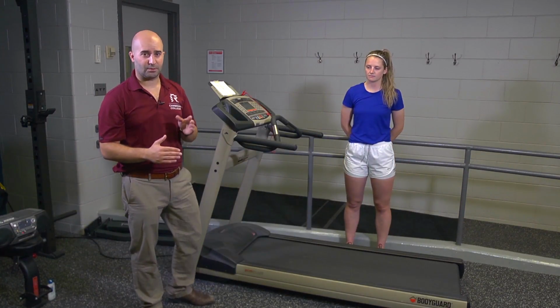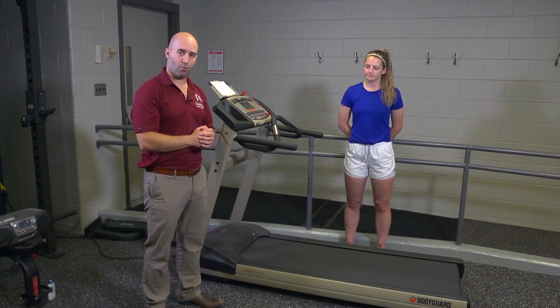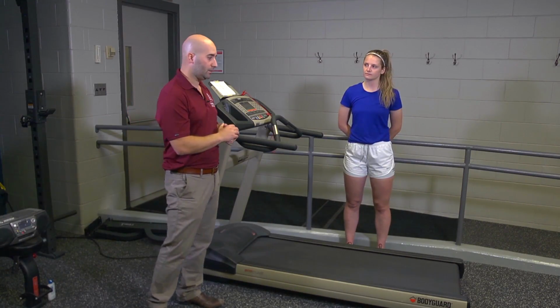The range for everyone is between 120 and 150 beats per minute. And so essentially, at the end of the 4-minute warm-up stage, I'm trying to have a steady state heart rate between 120 and 150. That's my goal.